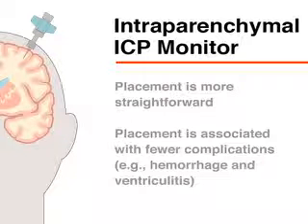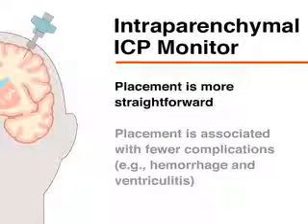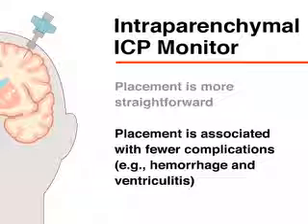Although these monitors do not allow for therapeutic drainage of cerebrospinal fluid, they are more straightforward to place, particularly if there is ventricular effacement or displacement, which is common in patients with traumatic brain injury. Intraparenchymal monitors are also associated with fewer complications, such as hemorrhage and ventriculitis, than external ventricular drains.